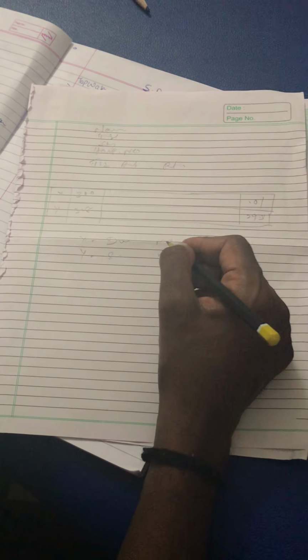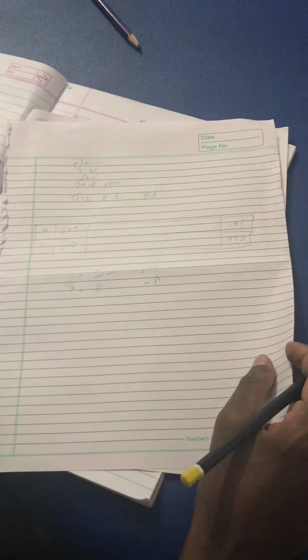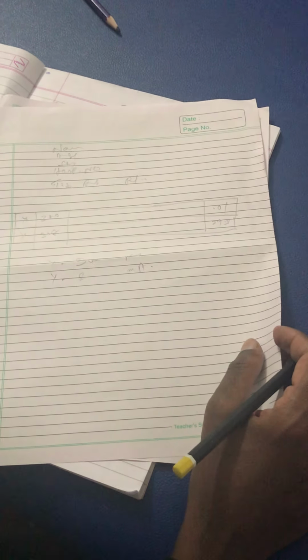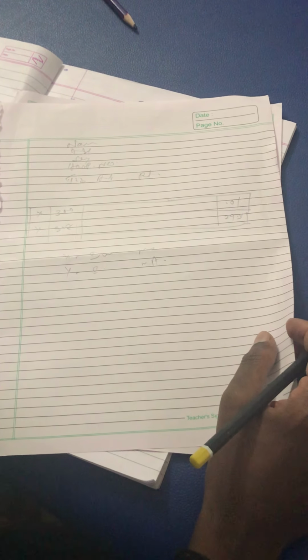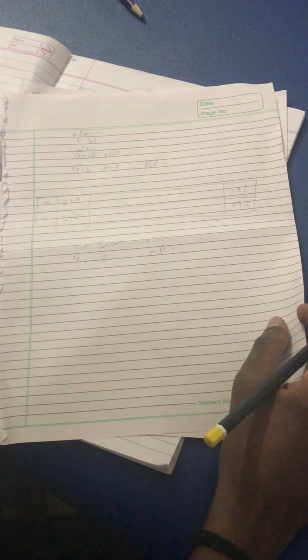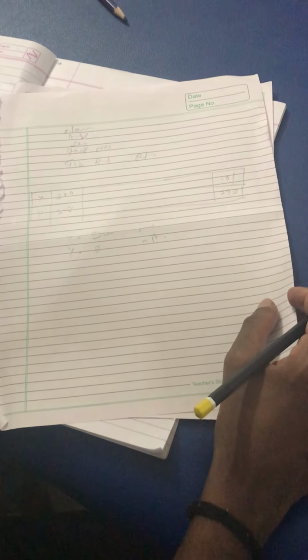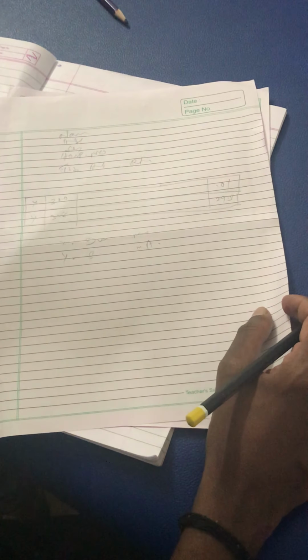This is a constant current stimulator. It's not a constant voltage, it is a constant current stimulator. You can see in Clayton's 9th edition that there are two SD curves given. One is constant current, and the one below it is constant voltage. Have you seen that book, Clayton's 9th edition? Still no? Please go and see that.